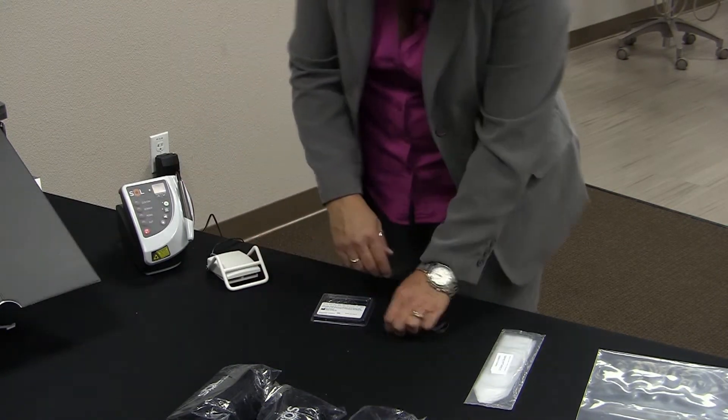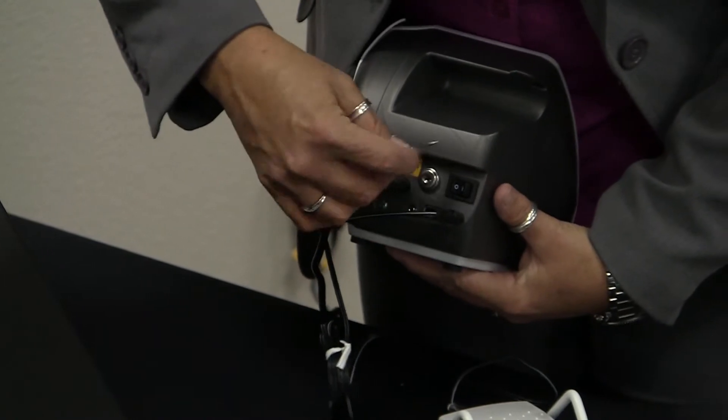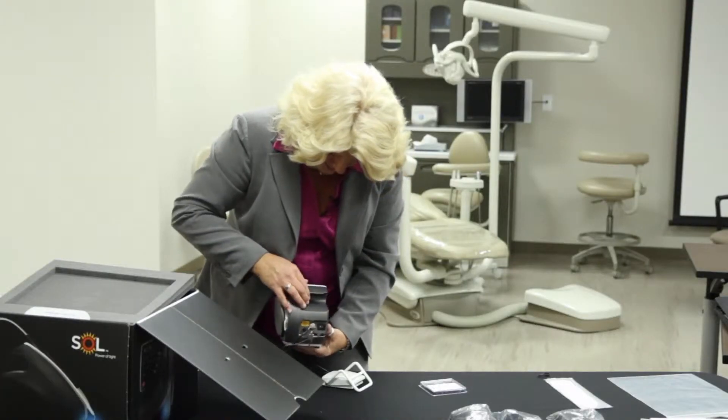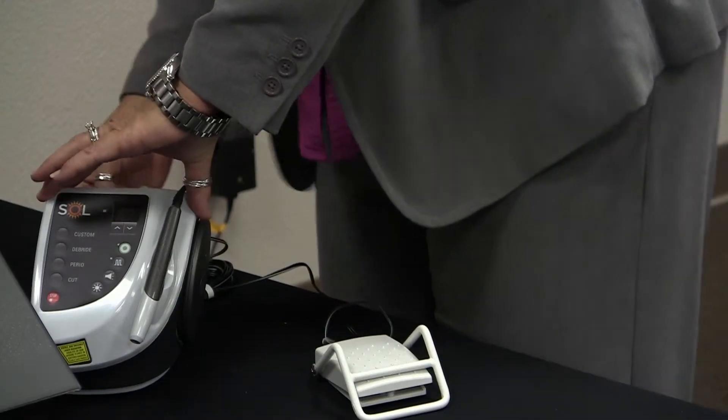The keys, as we spoke of — one goes in the back. This is for your security automatic shutoff. You can see here the key would fit in. A lot of offices just leave that in there so that they always know where it is. And there is also the on-off switch.